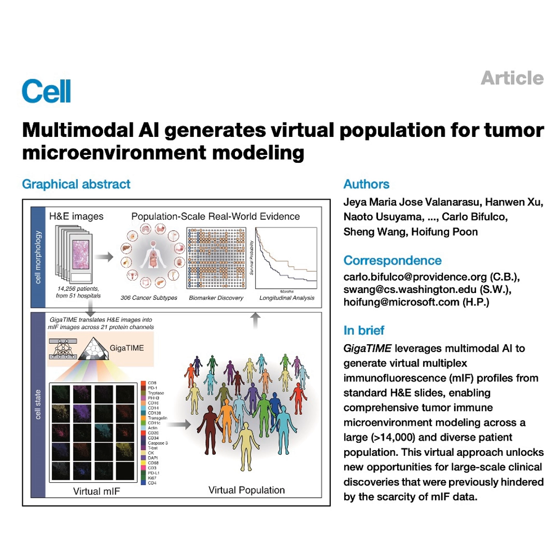The others were SNR, signal-to-noise ratio, which is pretty straightforward. How strong is the signal versus the background? And sharpness. And sharpness, which assesses how clear the edges and boundaries are. That's really critical when you're trying to understand where the tumor ends and the healthy tissue begins. And the big aha moment here was that these spatial metrics were often better predictors than just counting the cells. Much better, in many cases.